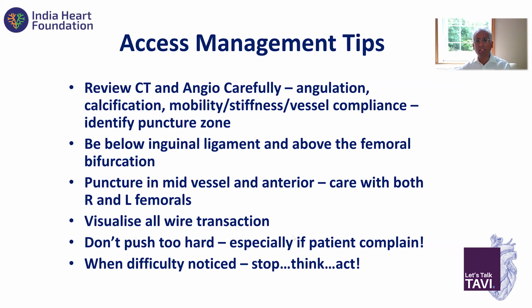Don't push too hard, especially if the patient complains. My patients are fully awake, and if they complain, oh, my tummy a bit, I stop, I look. And when difficulty is noticed, stop, think, and then act. Don't act, then stop, and then start thinking. And then I think the dividends will be very obvious. Thank you.